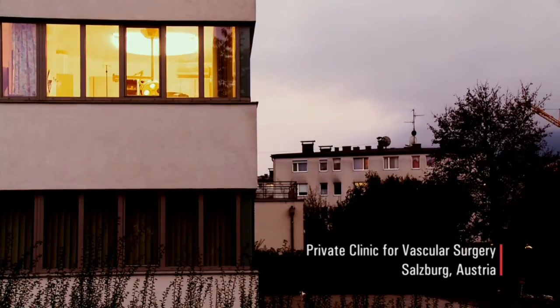We have different distances all the time, yes? First you are on the abdomen, and then you are 20 centimeters deep in the deepness, yes? And so you need different distances, and you cannot change the loupes. That's impossible. It's only possible to work with the head-mounted microscope. It's only possible.